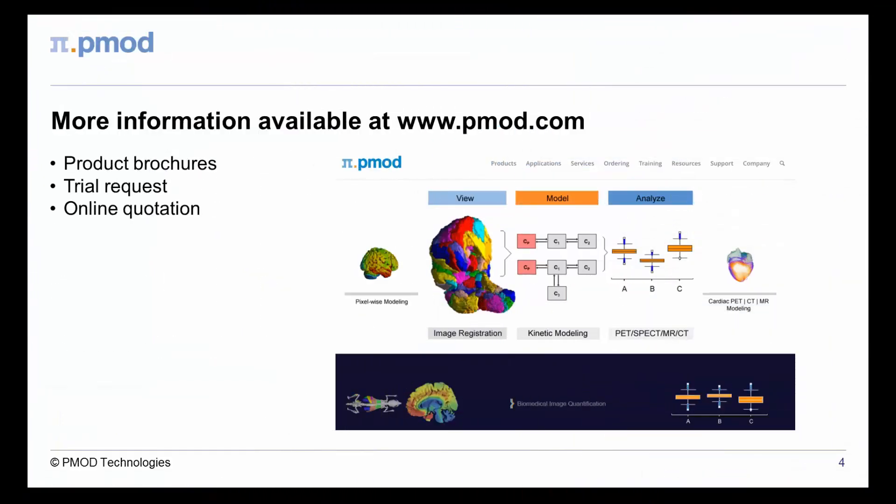In summary, PMOD supports a convenient dosimetry preprocessing workflow, interfacing directly to well-known dosimetry programs.